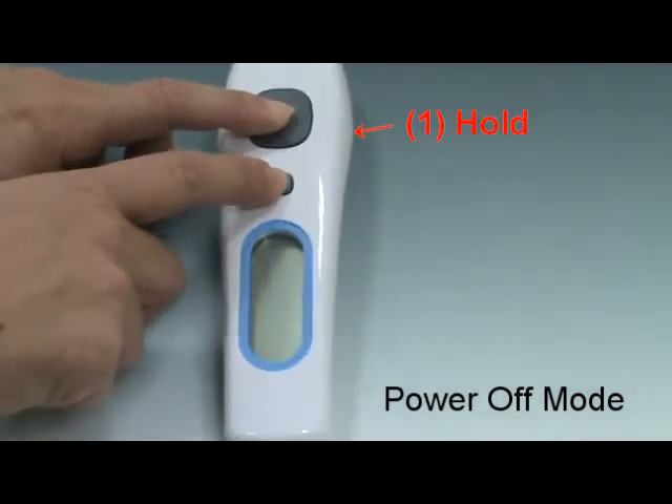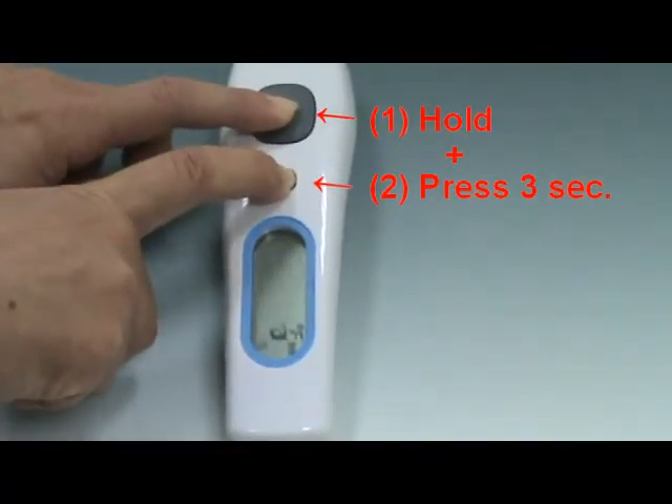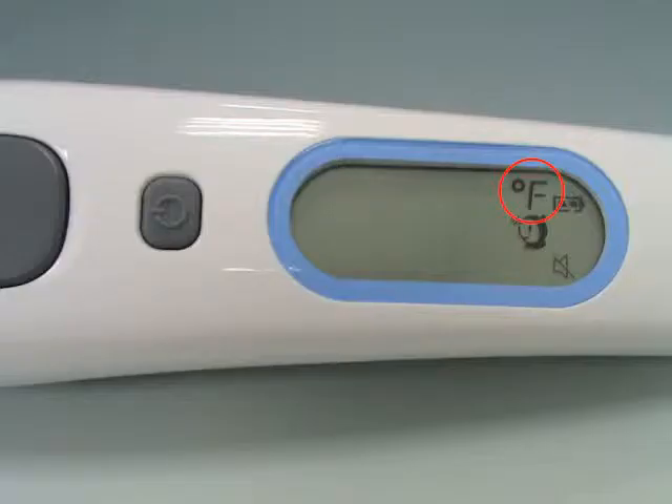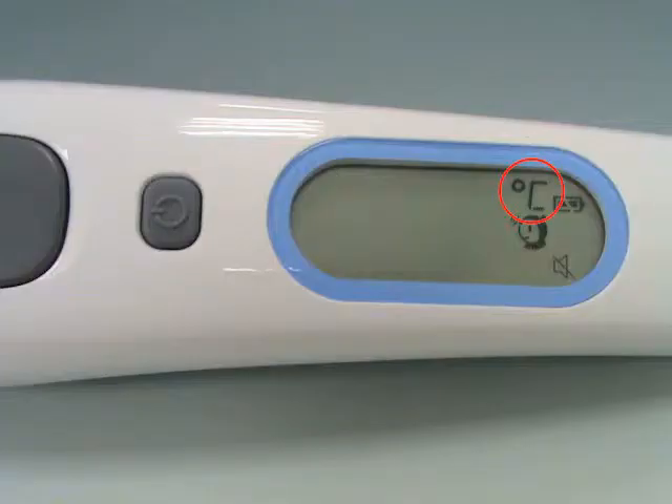In power-off mode, press and hold the stop button, then press the main button for 3 seconds. The icon will switch from degrees Celsius to degrees Fahrenheit. You can use the same process to change the display from degrees Fahrenheit back to degrees Celsius.